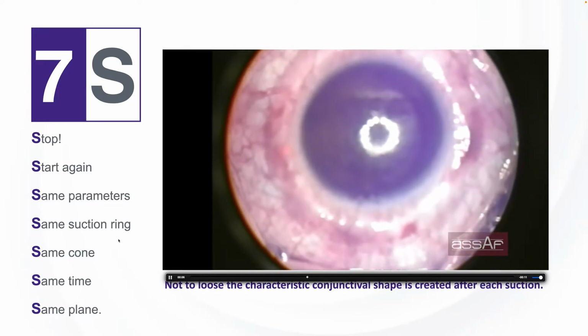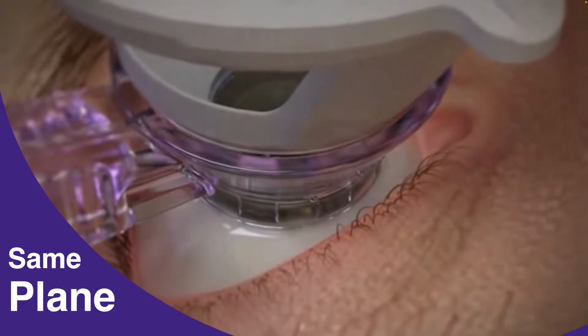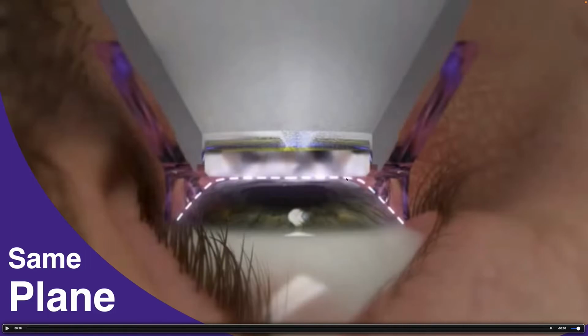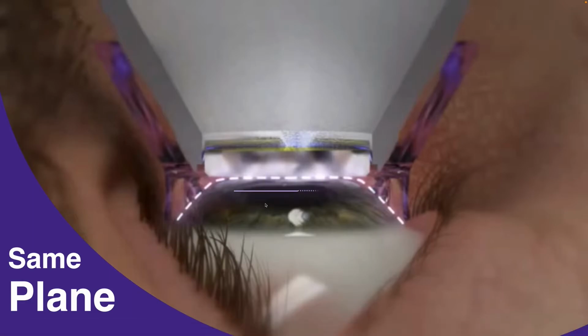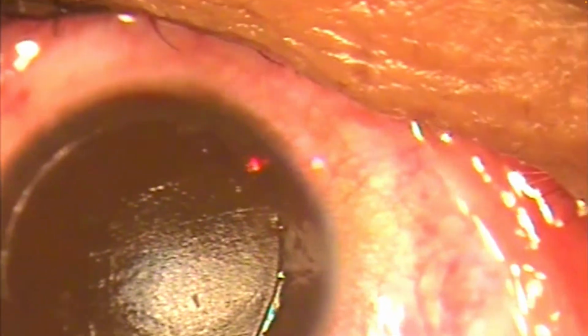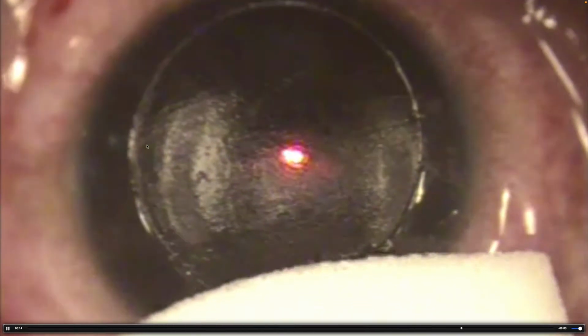Of course, we have to use the same suction cone. Using the same suction cone and the same parameters, same plane, may ensure the same depth for flap creation, because after applanation of the cornea, theoretically, because we have used the same glass cone, the laser will continue the flap creation in the same plane. So as you can see here, I have applied the same cone using the same parameters immediately after I recognize the suction loss, and start all over again for flap creation. And as you can see, the flap has been created again almost on the same location like the previous one, and we can proceed later on with the flap lifting without any consequences, and we have a decently smooth bed ready for excimer laser firing to correct the refractive error.